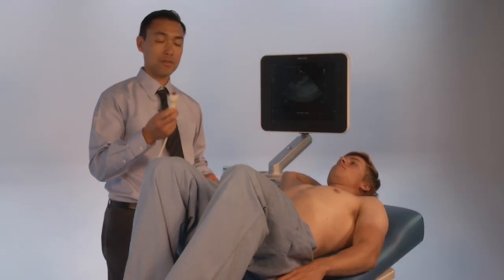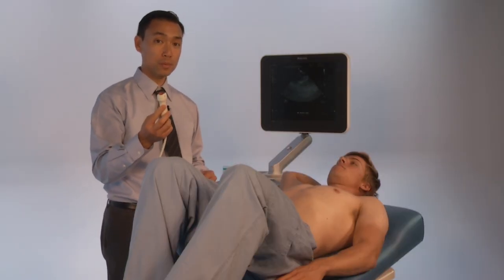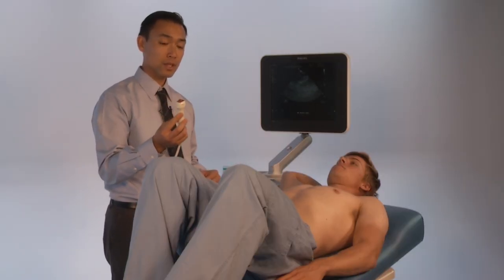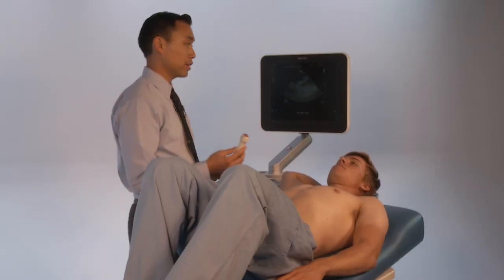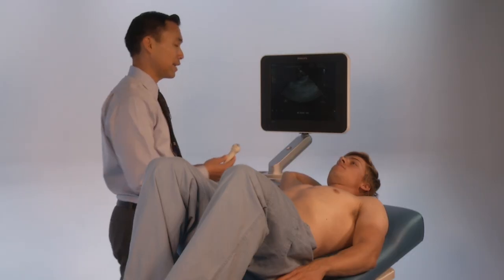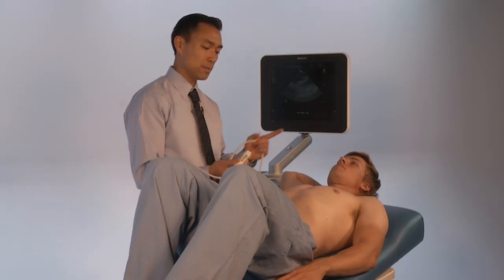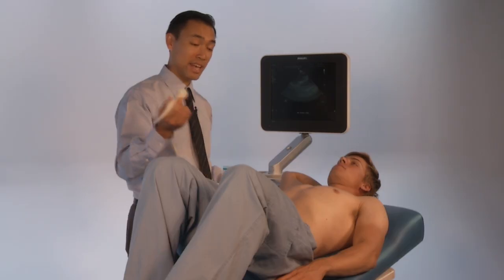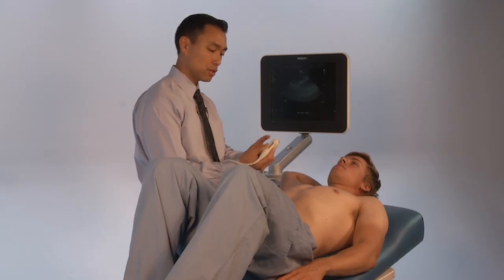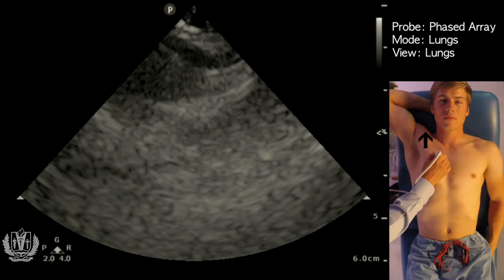You're going to be using a phased array probe on lung setting, or if you don't have lung setting you can use abdominal setting — that's fine. The indicator is going to be up towards the patient's head.